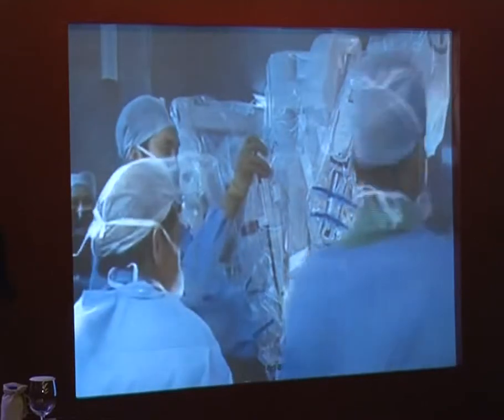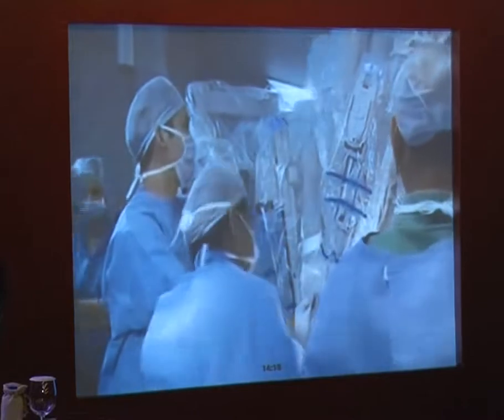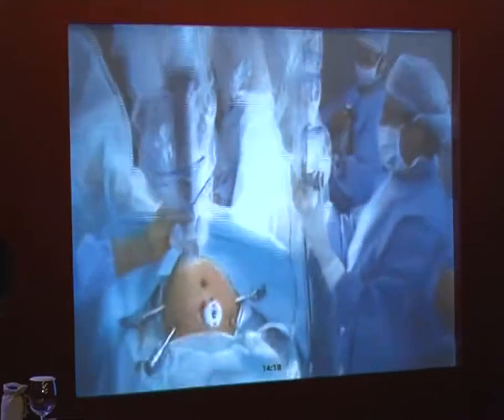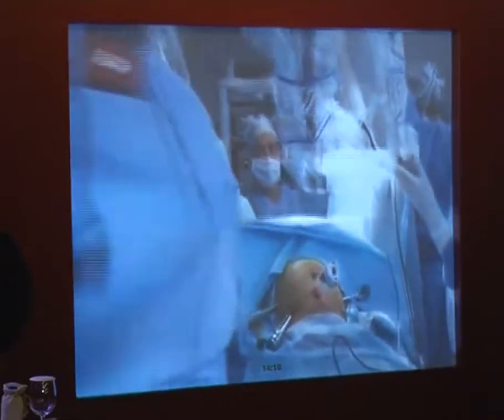Okay. So this one needs to come out first. All right. There's a lot of different ways to do side docking. One of the key things is that you want to make sure that you have the wings open and you've got good drape management. Otherwise, it's hard to get the ports in place.